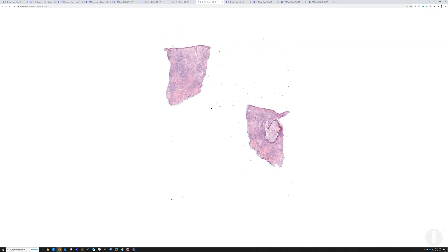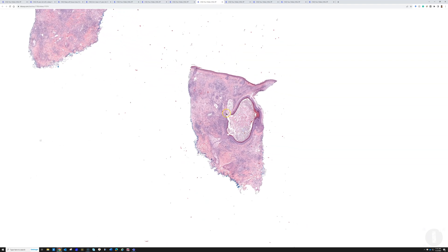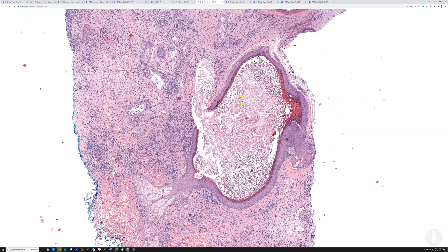Now we're totally changing topics. This case is from the nose of an adult patient — an erythematous papule that the dermatologist thought was either a ruptured cyst or a basal cell carcinoma. This is the kind of case that gives you bad dreams and nightmares, and I'll show you why, because there is a ruptured cyst here.